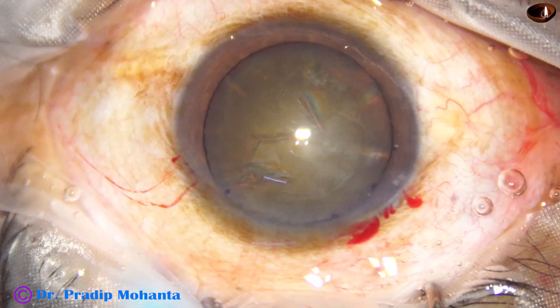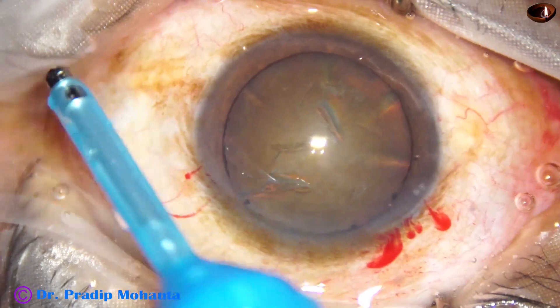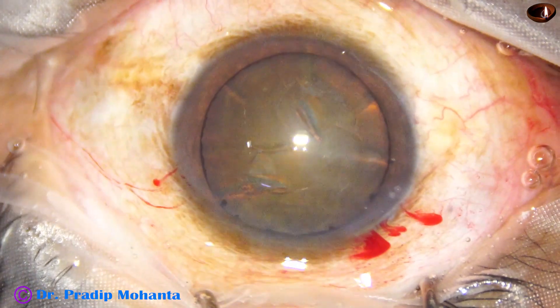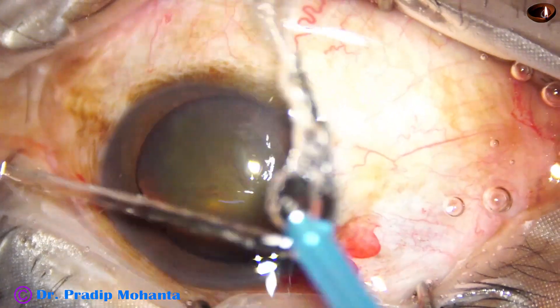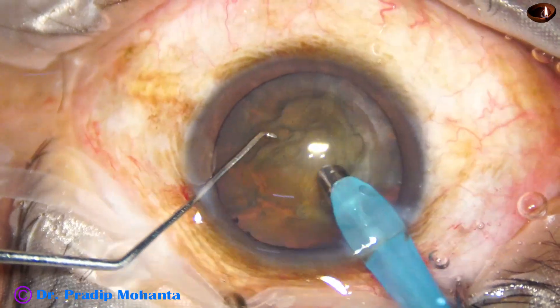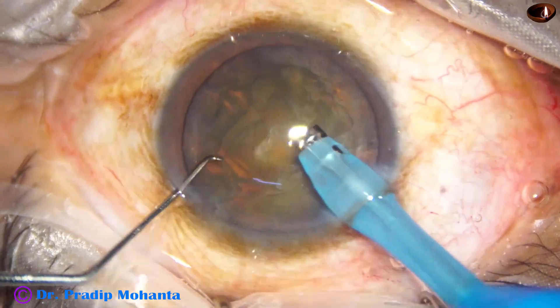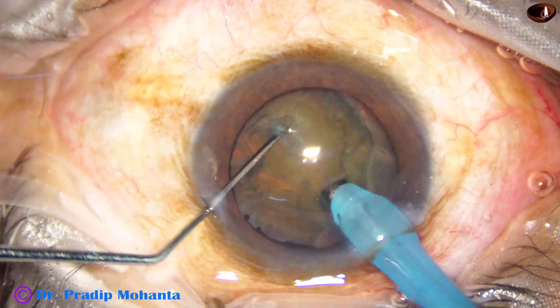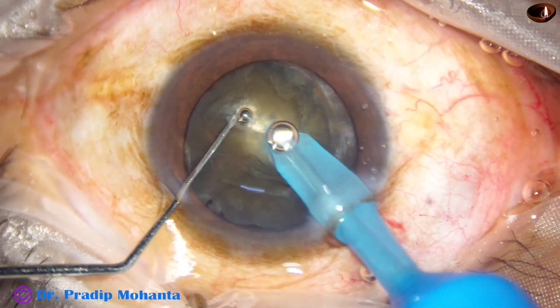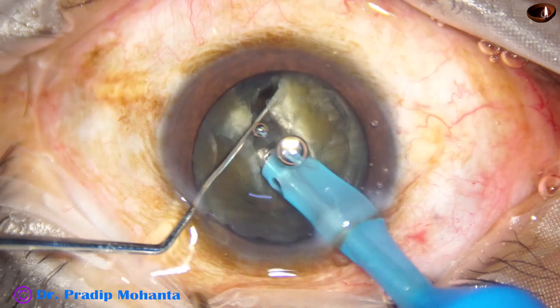Now is the time to divide the nucleus into some fragments. The technique I have mastered is known as the submarine chop technique, where the phaco tip moves through the substance of the nucleus as a submarine moves through water. Some superficial cortical lens matter is removed. The handpiece is turned to make the bevel off, and now the tip is buried in the substance of the nucleus. It goes through the nucleus towards the opposite equator, through a deeper plane, and the endonucleus is cracked.